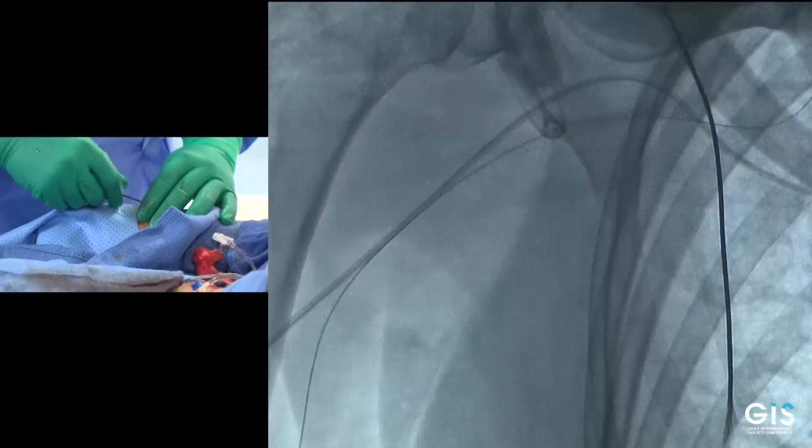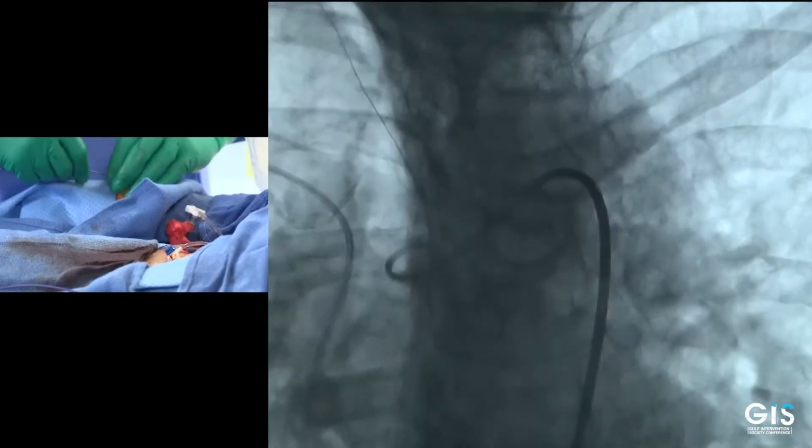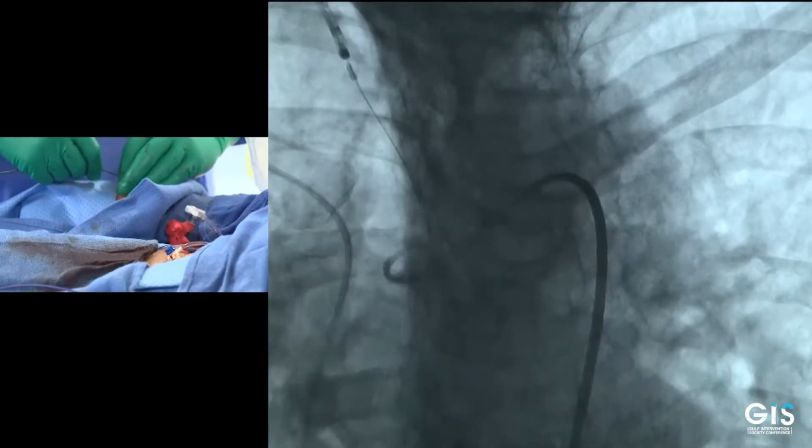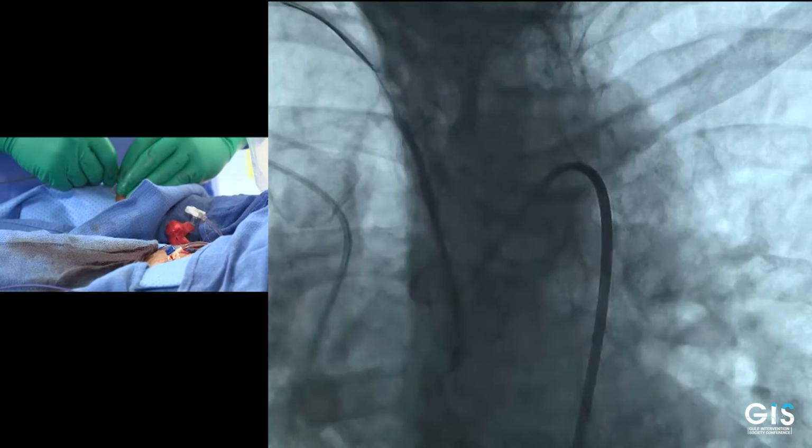Okay, follow. Okay, centralize us. Okay, hold it there. Okay, hold the wire. Okay, so we're coming through. Okay, so I'm going to fluoro again. We're coming through with this. I need you to store this. Okay, so until we get into this marker.